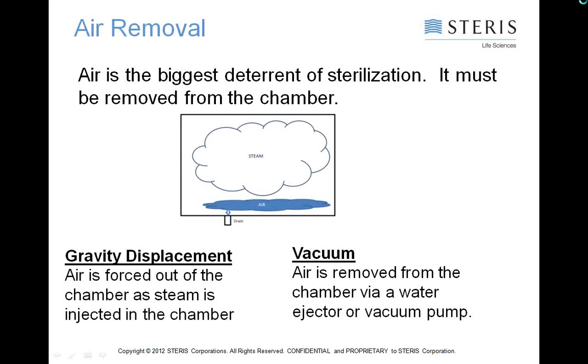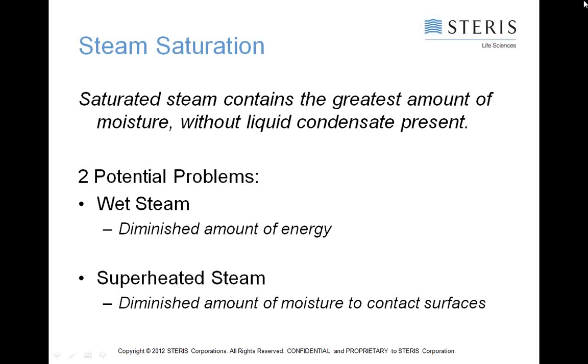And then finally, the last principle that we want to talk about is drying. This is at the end of the cycle, and it's important because, for proper sterilization, we don't want items to be wet when they come out. Liquids and open air are ideal transmitters of contaminants, so ensuring a load is dry is necessary to prevent recontamination.